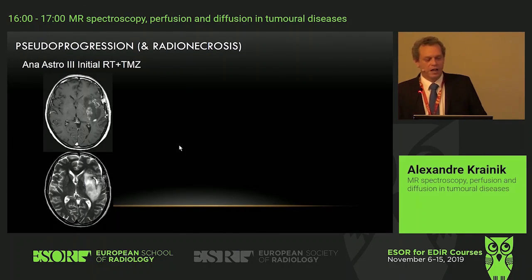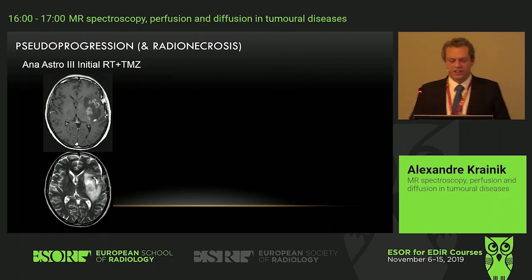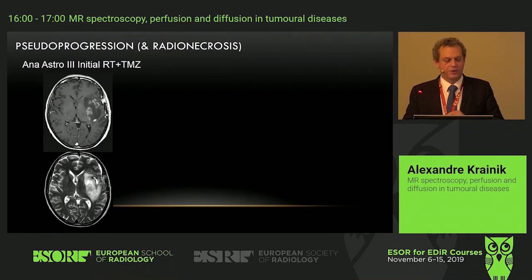Then first, besides this characterization of the tumor, you have to deal with pseudoprogression. It's the same principle for radionecrosis, but now radionecrosis are very rare. It has been observed quite a long time before when radiotherapy was not so focused as it is now. Now radionecrosis, I didn't see any for more than 10 years. But pseudoprogression is quite common.